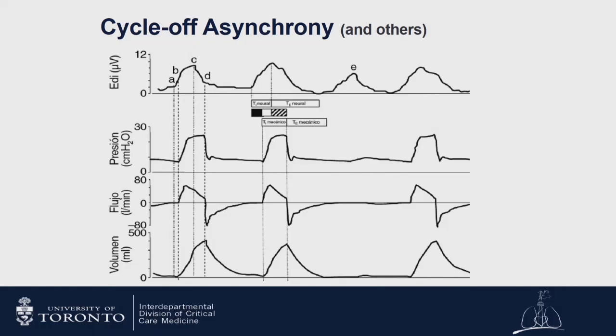the patient starts breathing in, as we see on the top line, and the ventilator hasn't done anything yet. And there's a bit of a delay until the airway pressure and the flow start. And then the patient's synchronous for a small amount. And then as soon as the diaphragm electrical activity has peaked and starts to go down, that means the patient's relaxed and is trying to be in expiration.